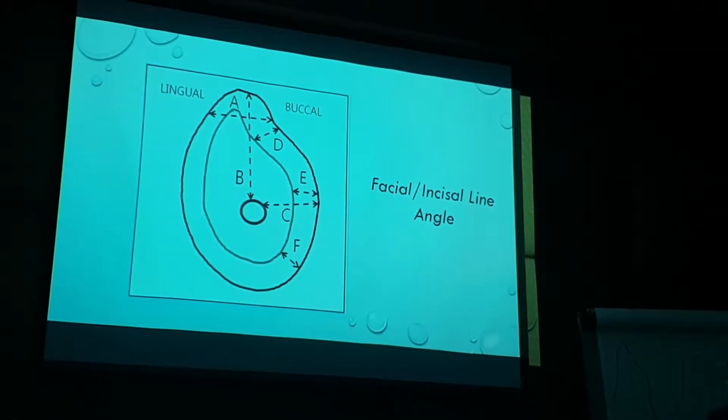this. So our strategy has to be either to take advantage of whatever facial incisal line angle there is, or compensate for that, or regenerate that. You get a better clinical outcome, a better aesthetic outcome. So now let's look at this ridge. It's less than ideal. What do we do here?